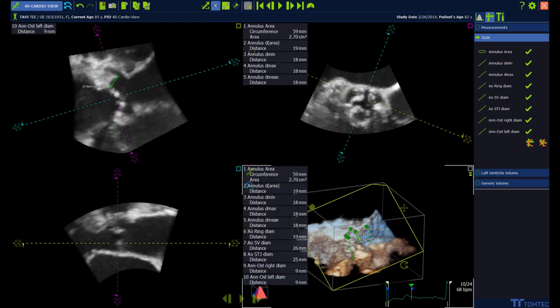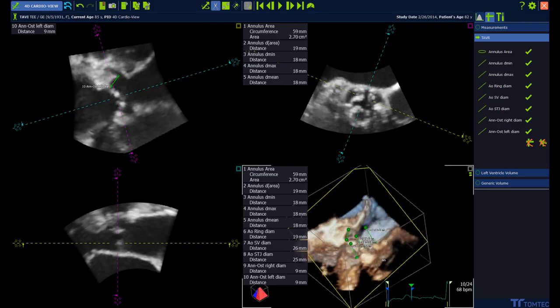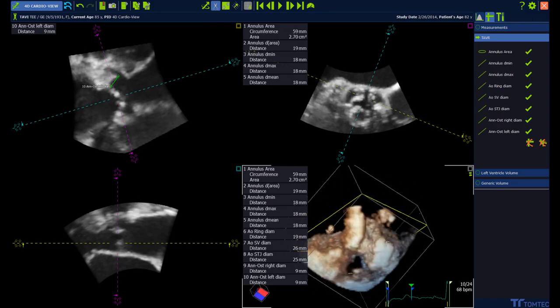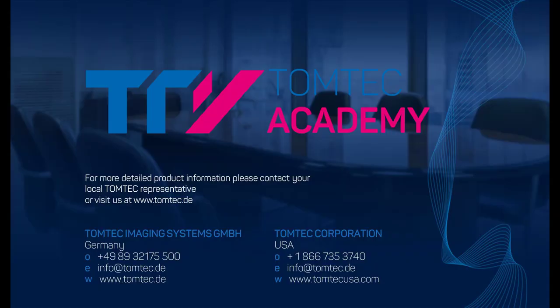Grab the cube, rotate, and see all the measurements.